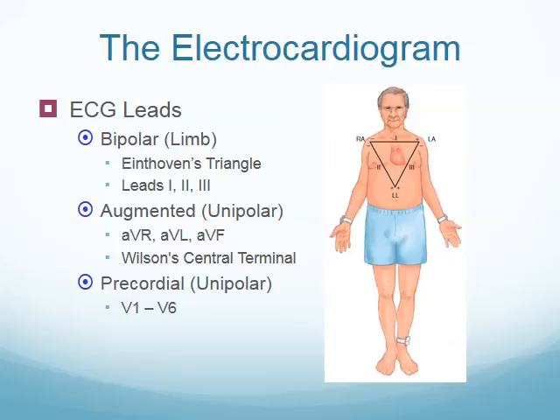Whenever we hook our patient up to the EKG monitor, generally using a 3 or 4 lead system, what we're doing is putting an electrode on the right arm, the left leg, and then the right leg. And this is just our 4 lead monitoring. Whenever we hook this patient up to the 4 lead monitor, we are obtaining a 3 lead EKG.